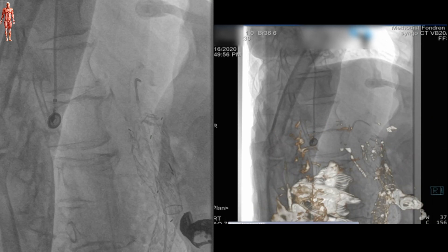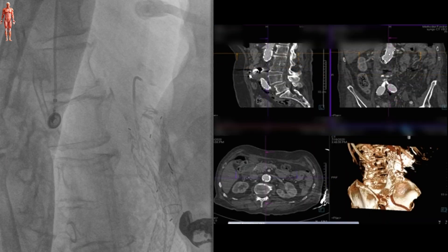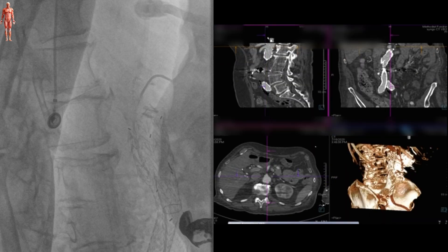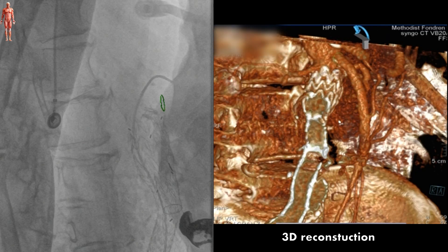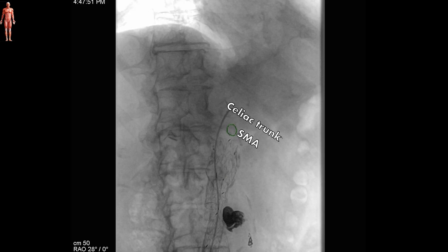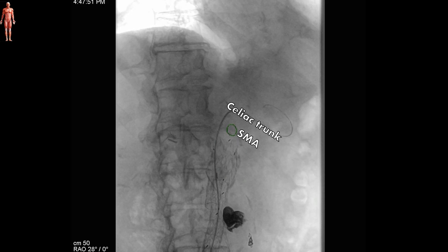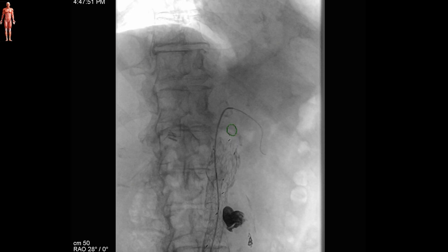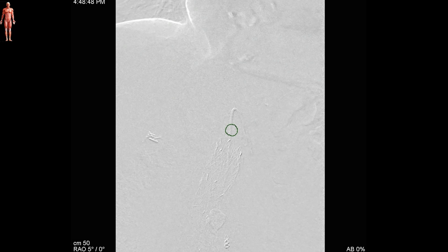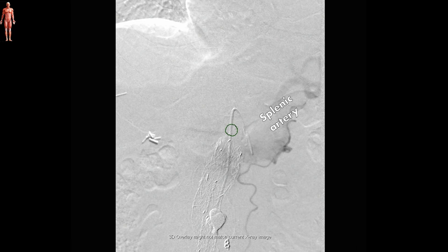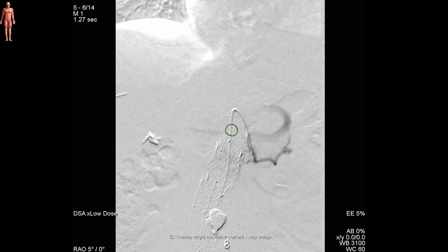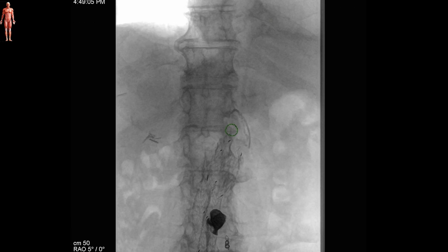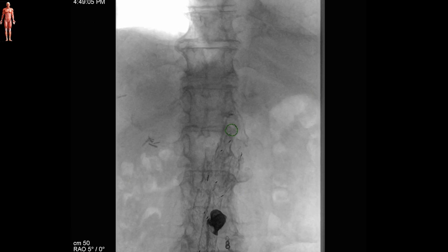The SMA was cannulated using a Radifocus C2 catheter and a hydrophilic guidewire. Usually this is done with steerable sheaths that have better manoeuvrability. A hand-injected contrast flush was used to confirm the catheter position.